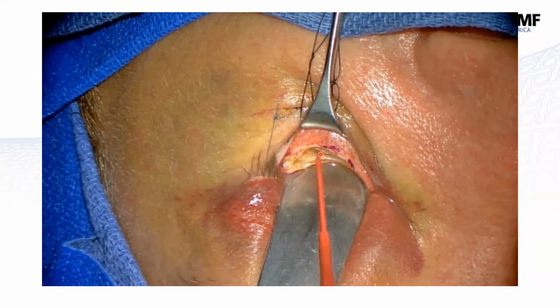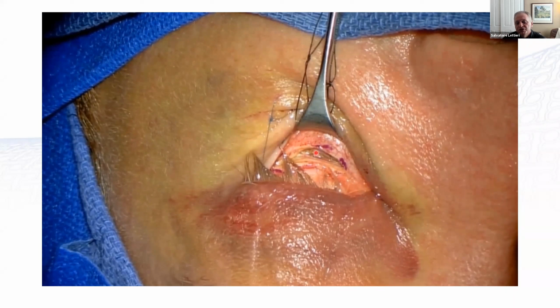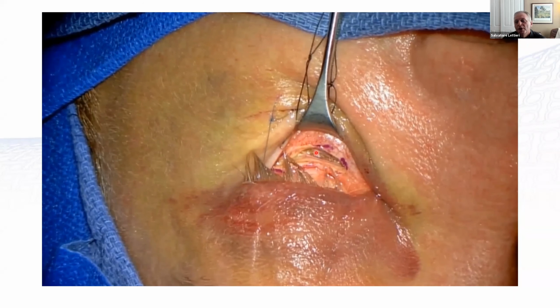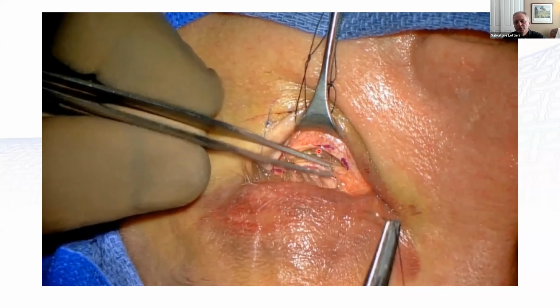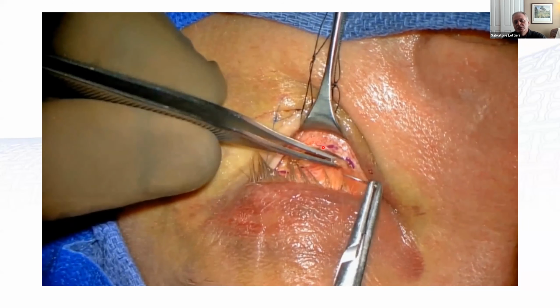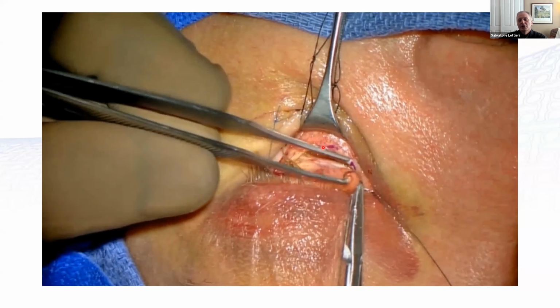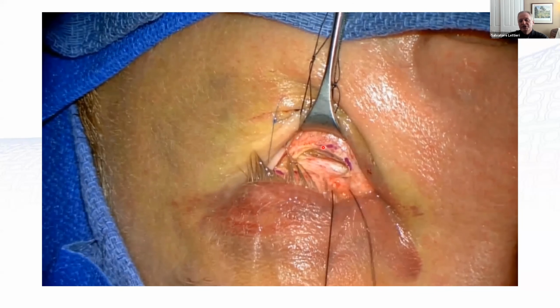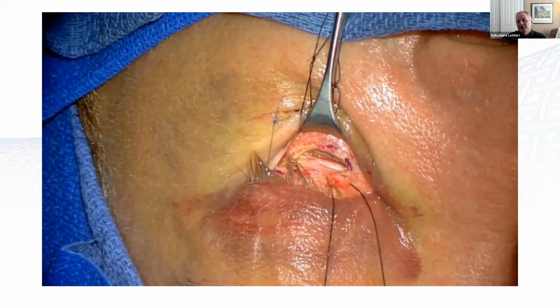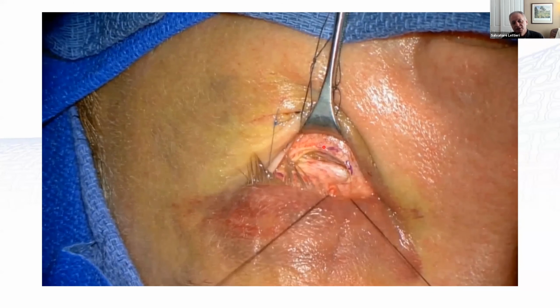Sal, how low of a setting do you use on your cautery? Whenever I use this, it depends, but I usually just start at 10 or 12. That's a good question. One thing you should remember is that anytime you grab that thing, it should be a knee-jerk response to ask about the setting. Thank you, Travis, because what you don't want is the normal blade setting of 30, because you'll really destroy the tissue. So I use a very low setting for that.